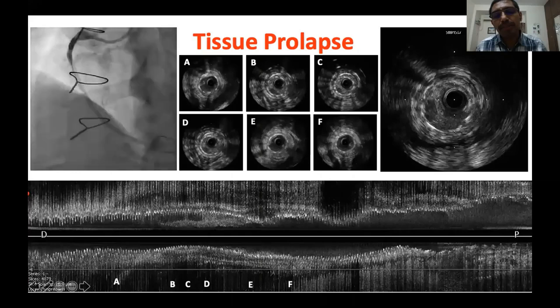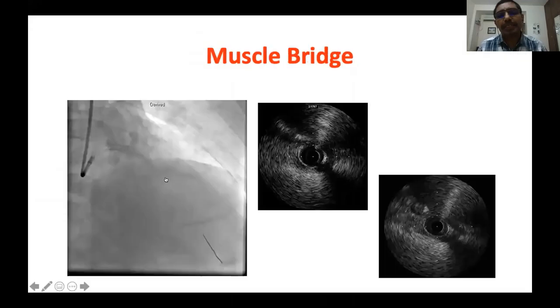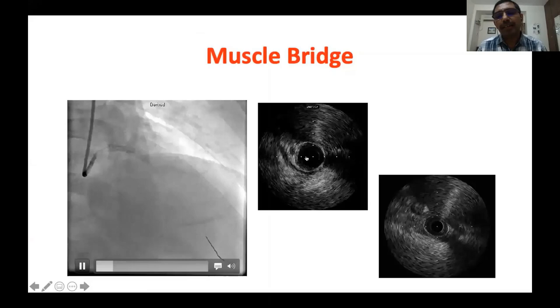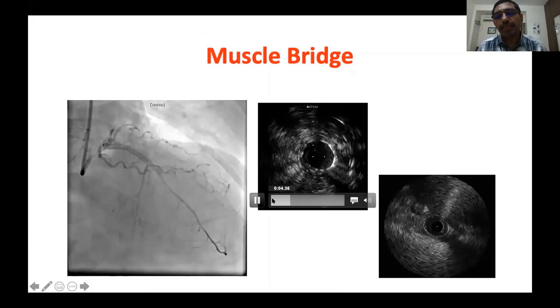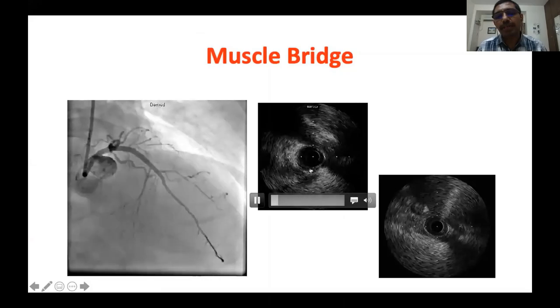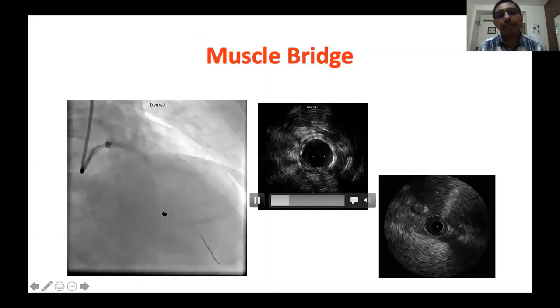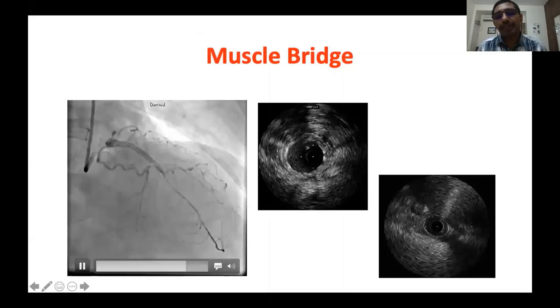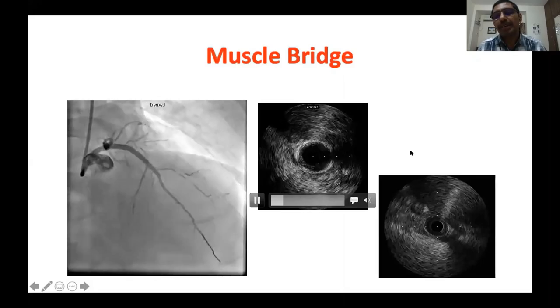Muscle bridge: here you can see the typical angiographic appearance of muscle bridge, and with IVUS you see the muscle layer going around the artery. The artery exhibits systolic squeezing motion — this patient was given a lot of inotropes, which accentuated the systolic compression. This is the typical appearance of muscle bridge on IVUS.